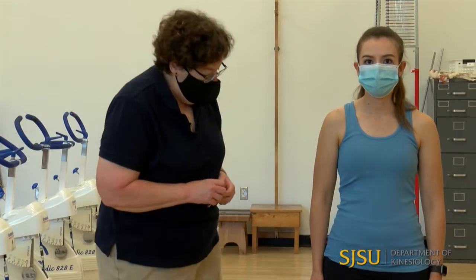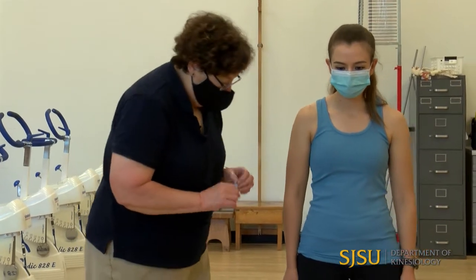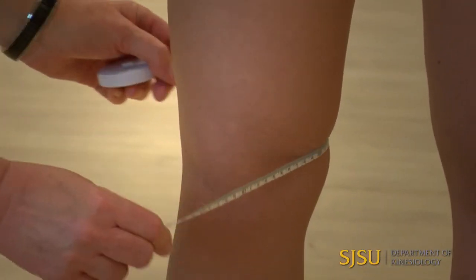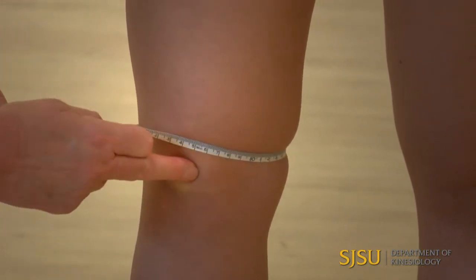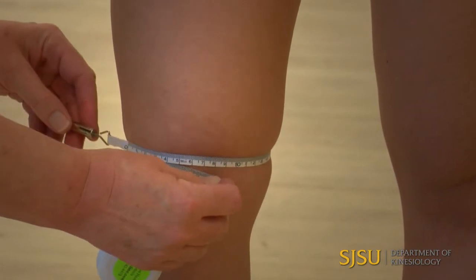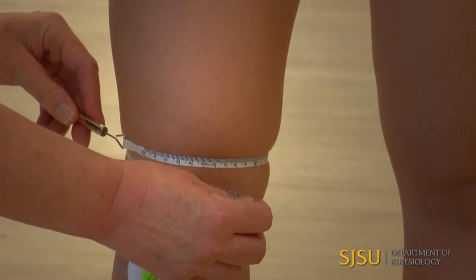Next is the knee measurement. We're going to measure right around the middle of the patella — again, right side of the body. The knee can be just slightly bent. Palpate and find the middle of the patella, wrap the tape around, and take your measurement.